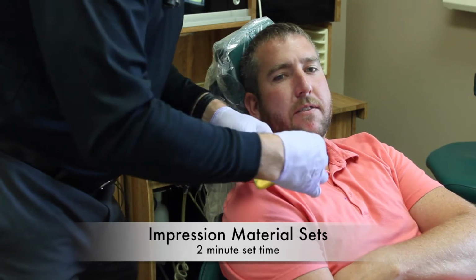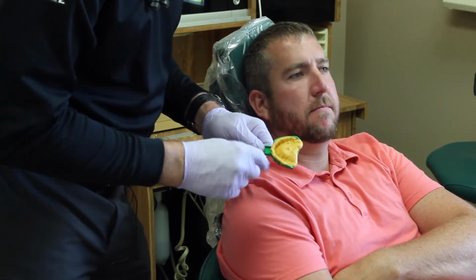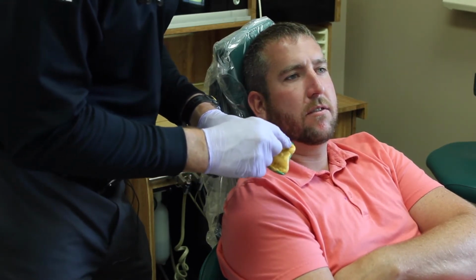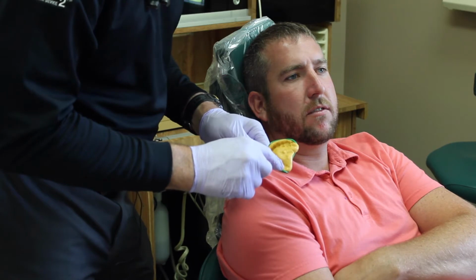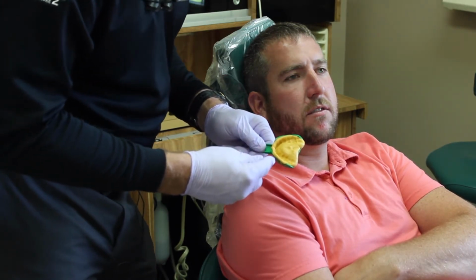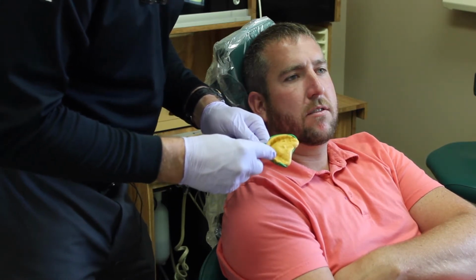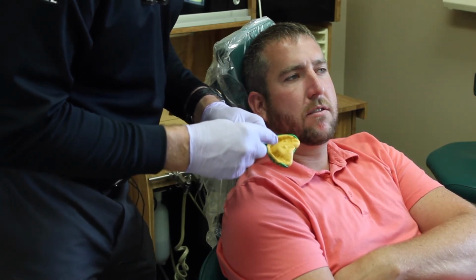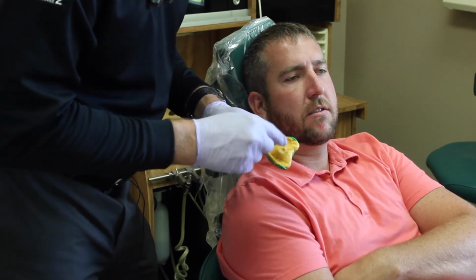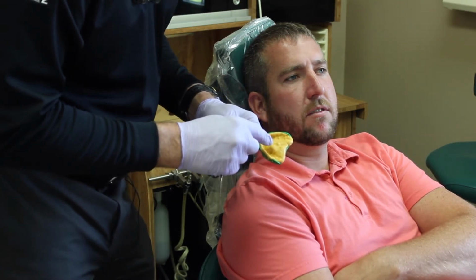Now you can see as I remove this saran wrap and you take a look at this impression that was a little bit underfilled, I've got pretty good adaptation here in the anterior region. It starts to thin out and disappear into this corner and into this corner. And so now I start to play with what I would call a little makeup light body. I'm going to go ahead and take a wash of this just to show you how, when the first step isn't done correctly, I can't really make it up in the second step. I'm going to have trouble filling the palate, and I'm going to have trouble getting these back corners. Let me show you that.